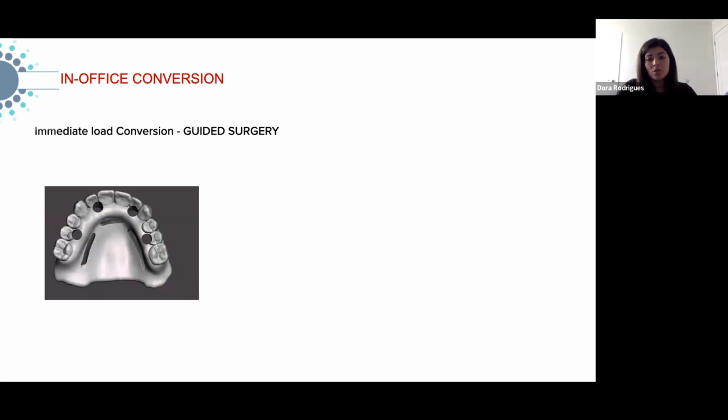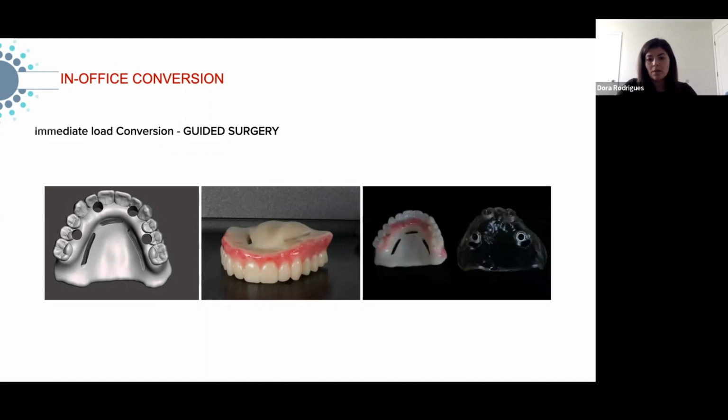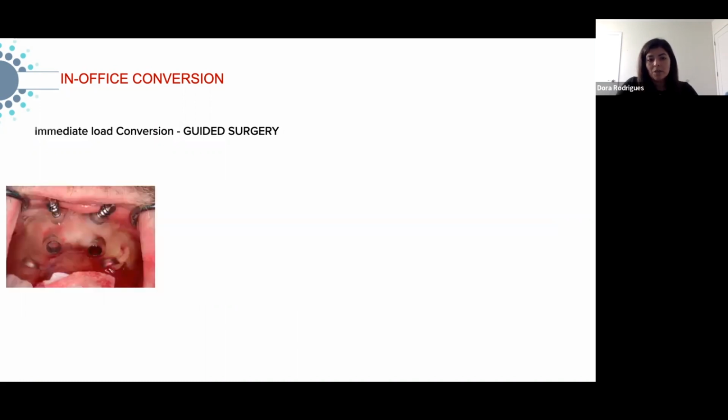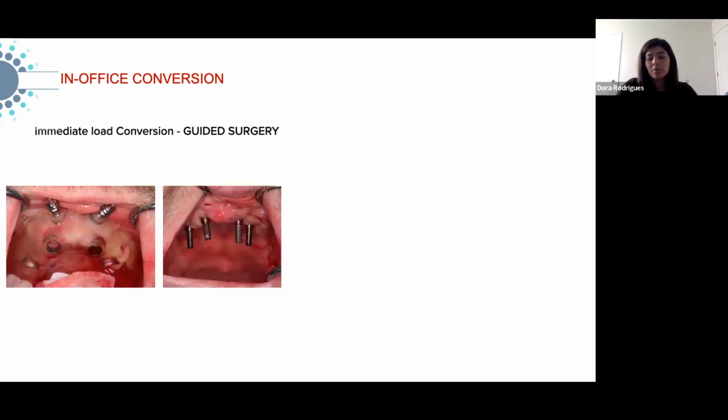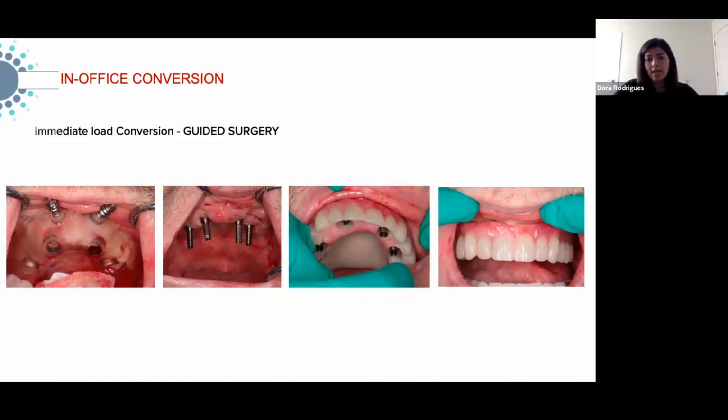And of course, with guided surgery, the good thing about it is that you know exactly, or you might know depending on the type of guide that they do, exactly where the holes are for the cylinders. So you can just print your temporary in one piece, and this is one of the cases that I did. I just add some composite around the teeth for the gums, and once we go for surgery, the guide is placed. They place the implants, the multi-unit abutments, and then your temporary should slide right through the cylinders, making the process a lot faster to accomplish.